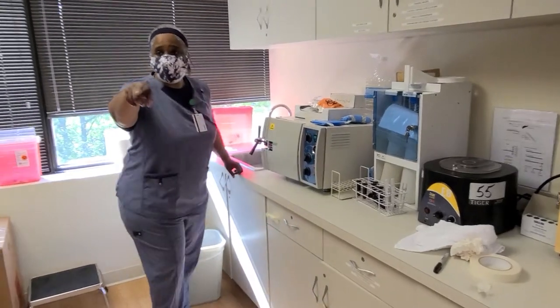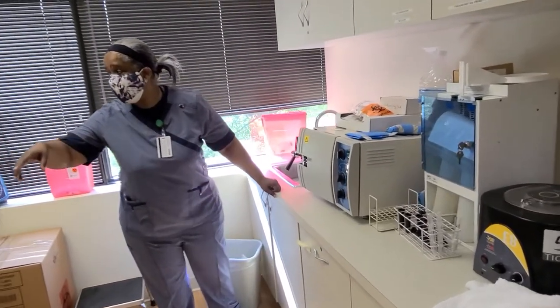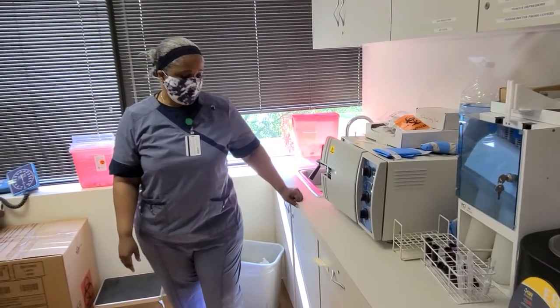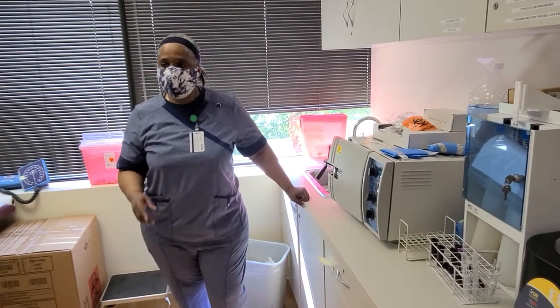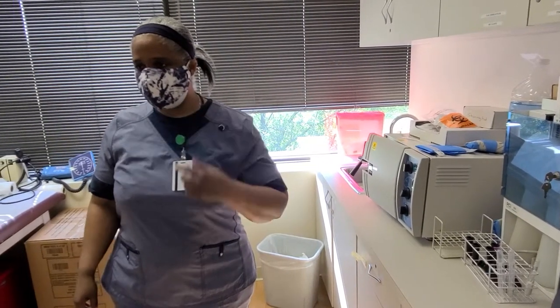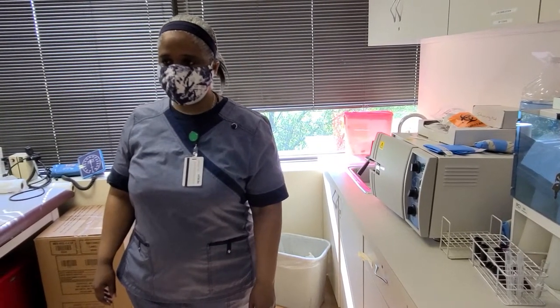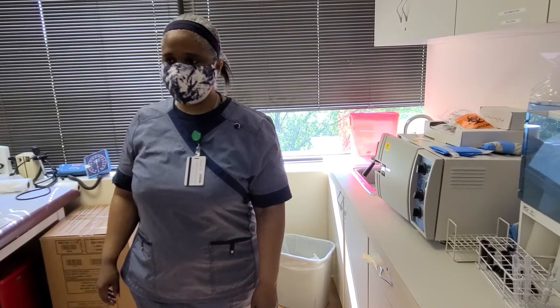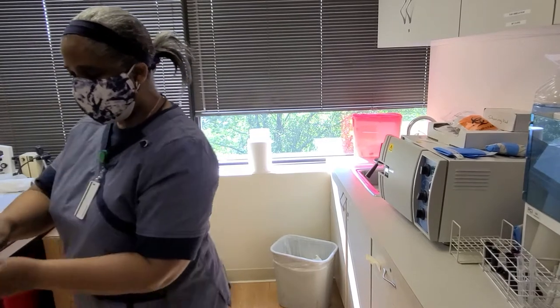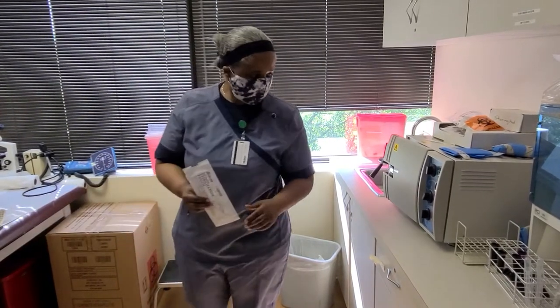Whether it's going to be in that pouch that I'm autoclaving or whether it's going to be the instruments in a muslin wrap. Now, if somebody can hand me one of those pouches, one that's not autoclaved, I appreciate it. The pouch. Yes, thank you. So, this has a plastic side and a paper side.